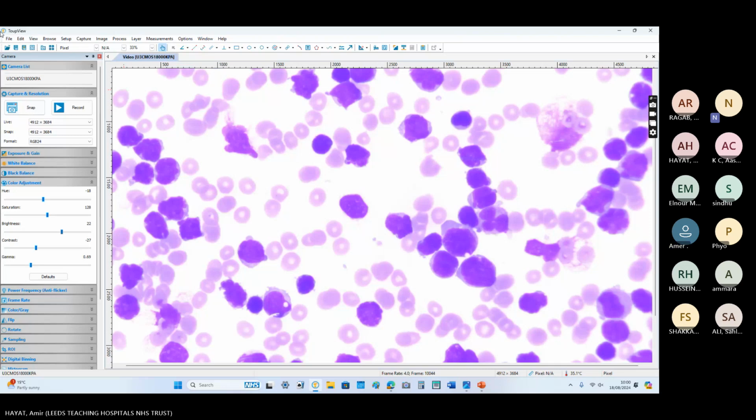But in this case, this patient also has thrombocytopenia, which could also cause intracranial hemorrhage. I think I mentioned the platelet count is 94. So not that low to cause a bleed. But on smear, they don't seem to be 94. Yes, few platelets are visible. This is a 50x field, so you can see multiple here.